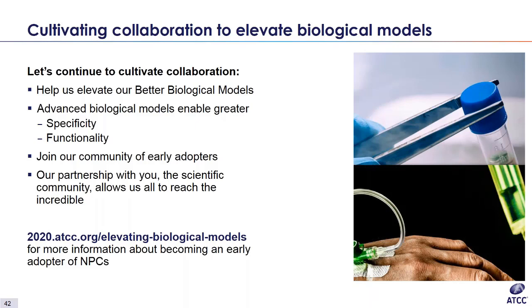You mentioned the addition of CHIR 99021 to the media for differentiating the Parkinson's disease-derived NPCs into dopaminergic neurons. Where did you get the compound from, and what concentration is it used at? For differentiating ACS-5001 neural progenitor cells to dopaminergic neurons, you have to add the CHIR 99021 to a final concentration of 5 micromolar. We get the compound from Stemgent, catalog number 04-0004-10. The compound can be added to an aliquot of dopaminergic neuron media and stored at 4 degrees C for about a week.